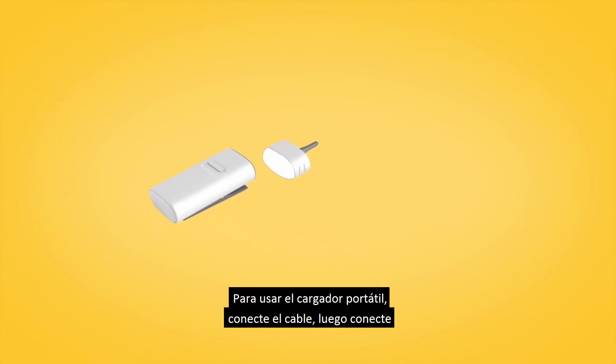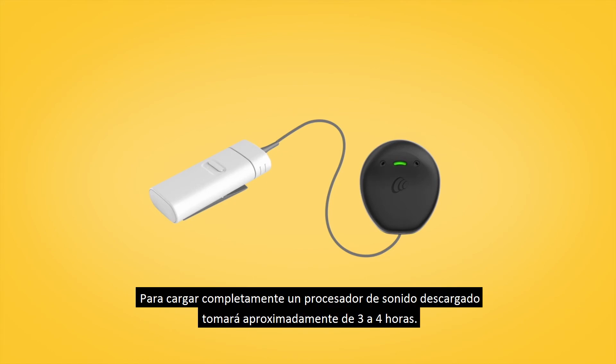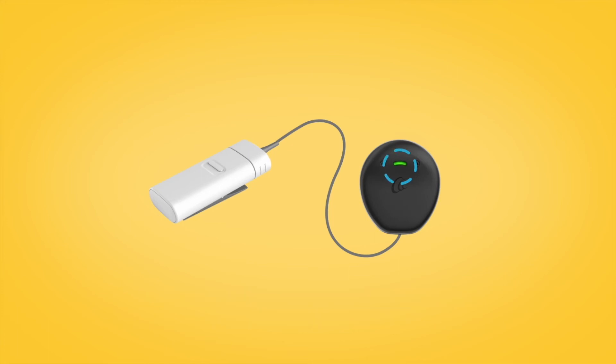To use the portable charger, connect the cable, then attach the cable to your Kanzo 2 Sound Processor socket. To fully charge, a depleted sound processor will take approximately three to four hours. When fully charged, your Kanzo 2 Sound Processor will display a steady green light.